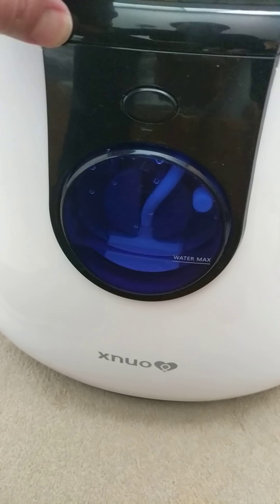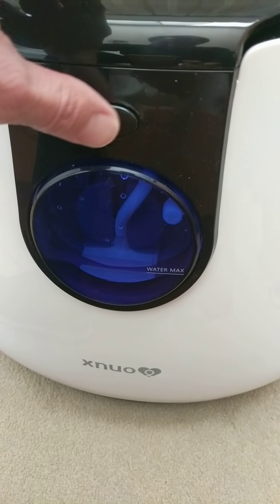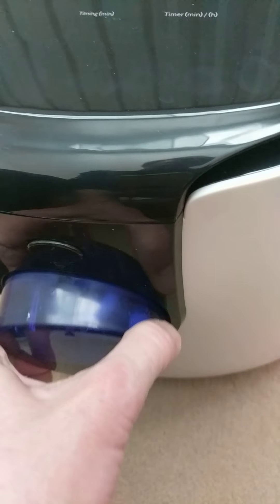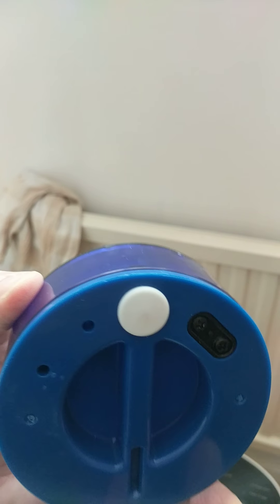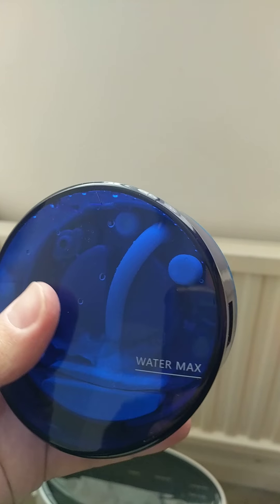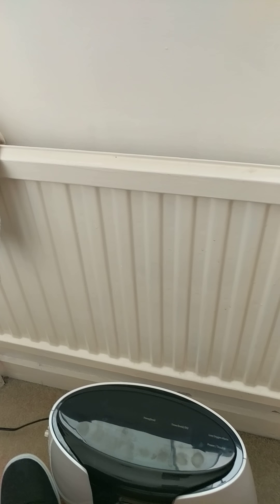Notice it's got a water tank on the front which you can push out. This is where you fill it up with water through this little white plug thing. I've filled it up to the max level and will now place it back into the unit itself.